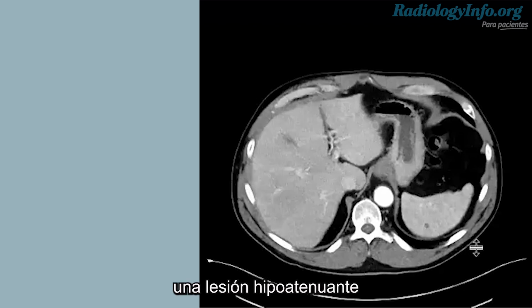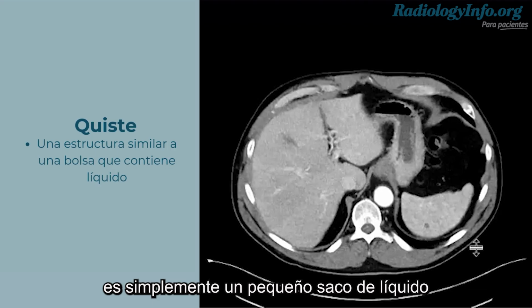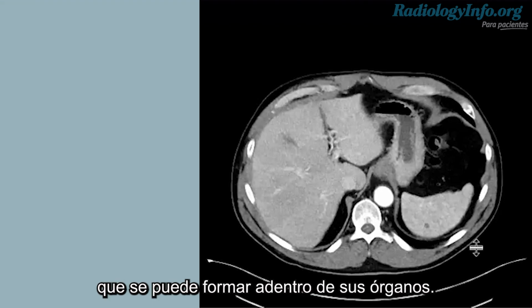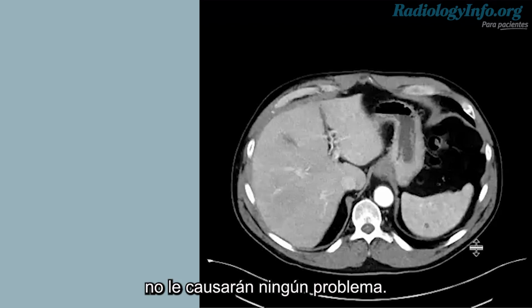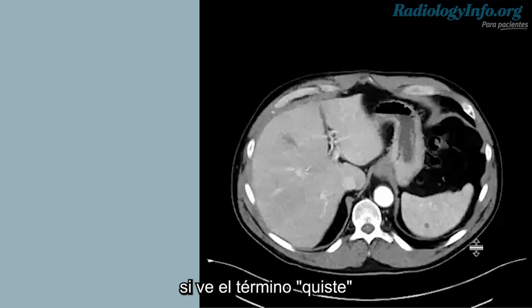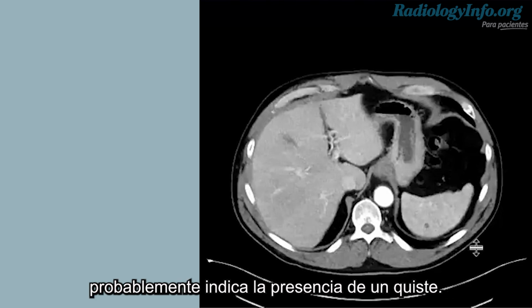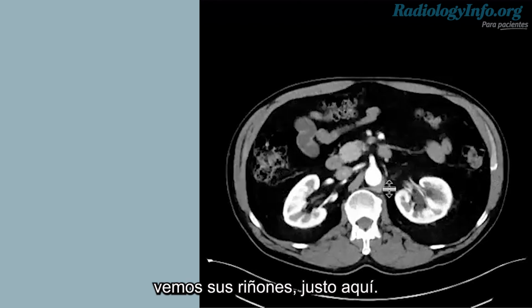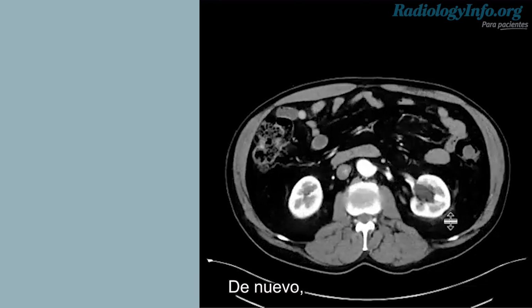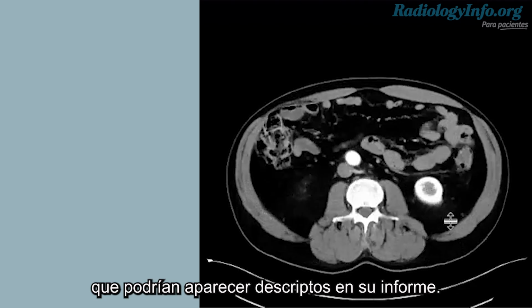Most commonly, a hypoattenuating lesion will end up being a benign cyst. A cyst is simply a small little pocket of fluid which can form inside your organs. They are very common, and they almost certainly will cause you no harm at all. So don't be frightened if you see the term cyst or a small hypoattenuating lesion, which likely reflects a cyst. And behind your adrenal glands, we'll see your kidneys right here. And again, cysts are very common in the kidneys, as well as kidney stones, which may be described in your report.